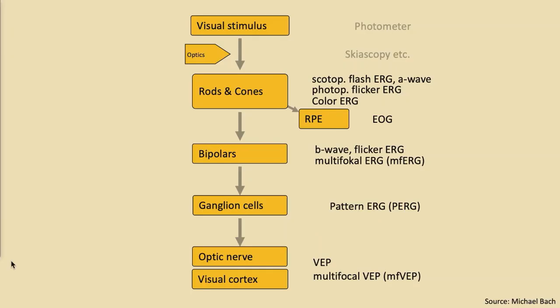And that's already something that we've heard before, that if something early in that chain does not work well, then this will affect what we measure at a later part of the chain. Which doesn't mean that this is necessarily completely useless to measure here, but we need to know that effects could come from earlier stages.